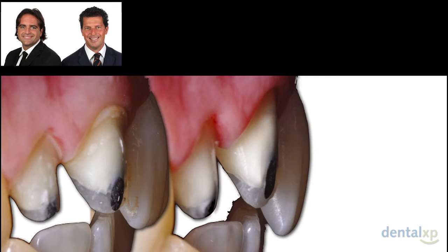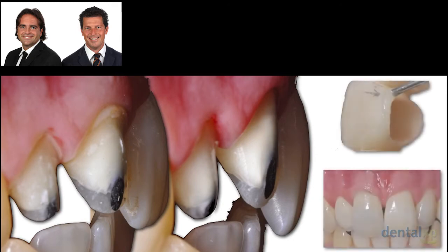So in order to be as conservative as possible, we decided to switch the finishing line, passing from a horizontal finishing line to a vertical finishing line that allowed us also to manage prosthetically only with the provisional restoration by adding some flowable composite while realigning the provisional restoration in the patient's mouth and managing also these gingival asymmetries.